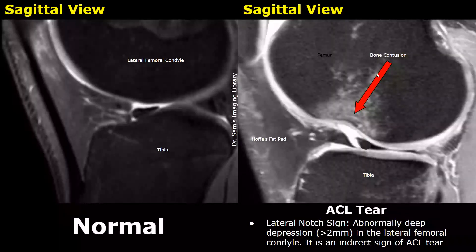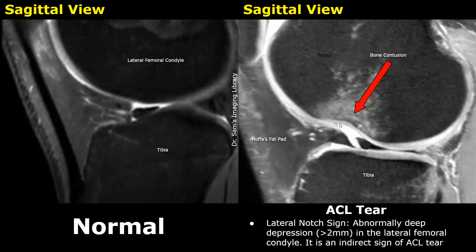In some cases of ACL tears, a lateral notch sign is present. Due to trauma, there can be an abnormally deep depression in the lateral femoral condyle. Its measurement is usually more than 2 millimeters. It is an indirect sign of ACL tear.